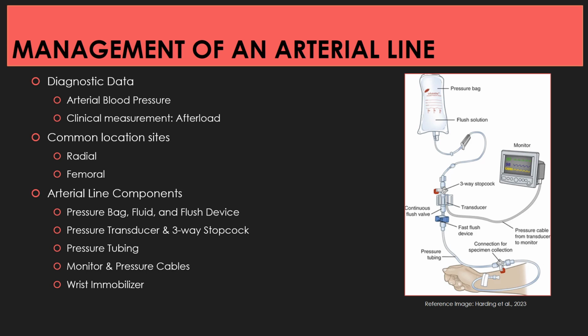So ART line blood pressure is more accurate than a cuff blood pressure reading. And also, when we are titrating medication drips with our critical patients, it's useful to know the second by second blood pressure alterations in response to the medical therapy we are providing the patient.